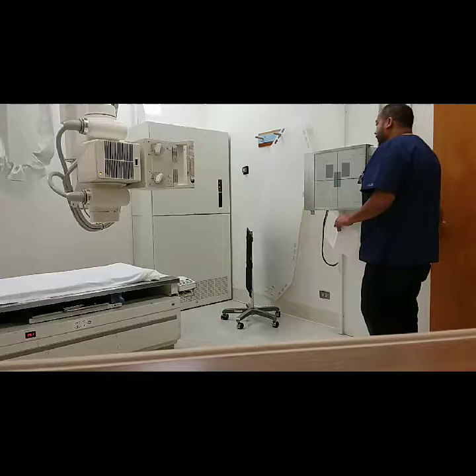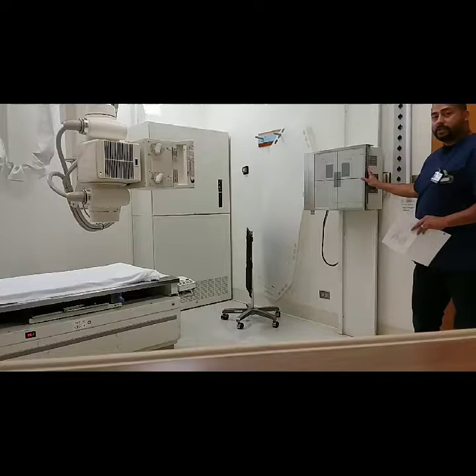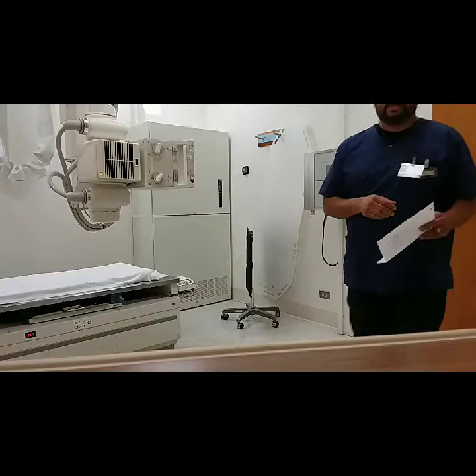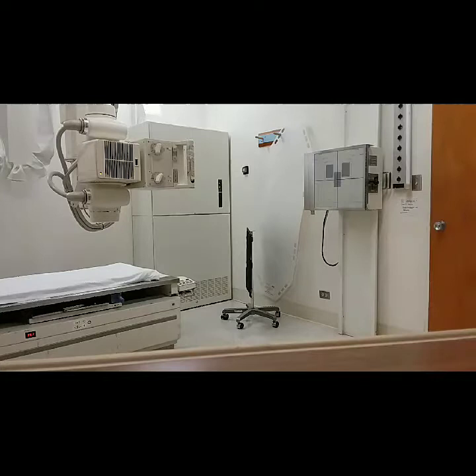Now that I have an understanding of who my patient is, I'm going to leave the Bucky IR crosswise for chest. I'm going to set my technique at 110 kV, about 8 mAs — he's a smaller individual, so we don't need that much mass.